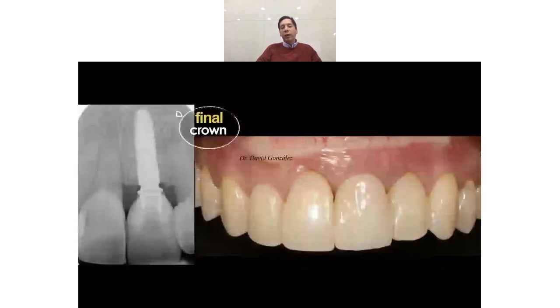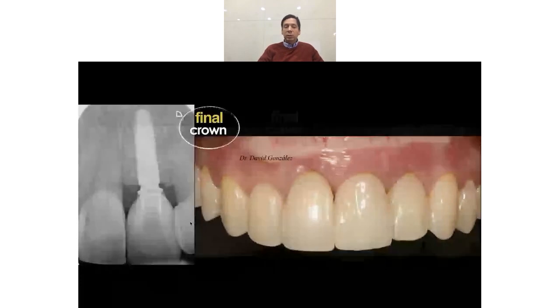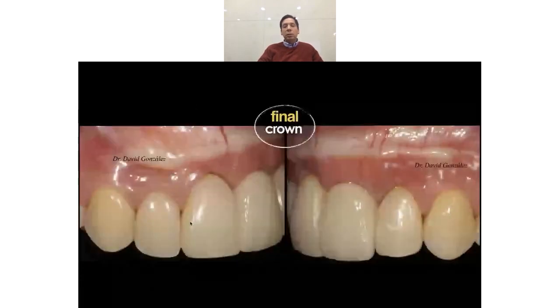And this is the final crown. The final crown that was made by Dr. Rafael Navarro. Here we can see that he made some composite on this tooth, and this is an implant supported crown. This is the final result. This is a lateral view. I like the emergence profile of the implant supported crown better than that of the natural crown.